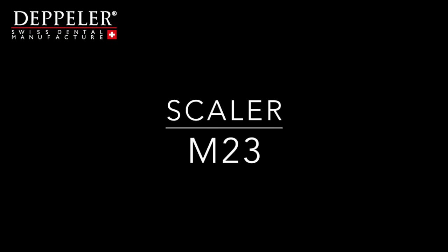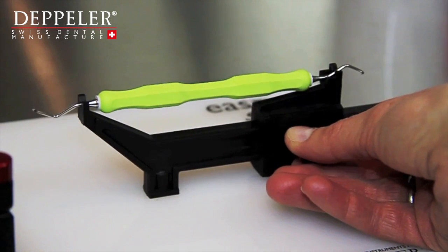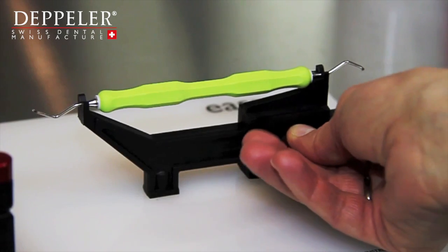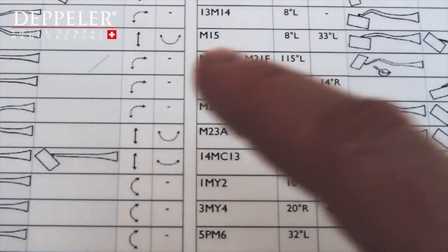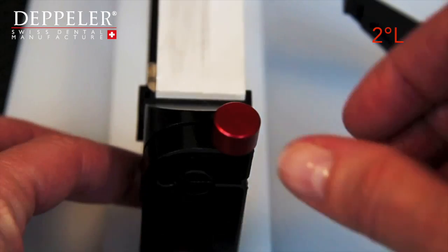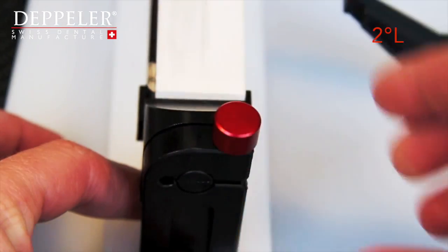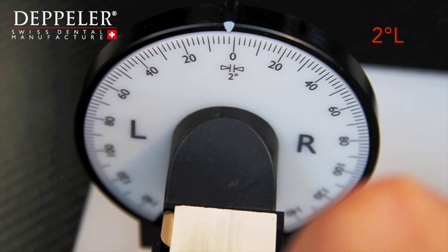Let's take the M23 universal scaler. Put the instrument on the support and adjust it according to its length. It must be able to turn on itself but mustn't move back and forth. Look for the reference M23 on the list. The first angle is 2 degrees to the left.